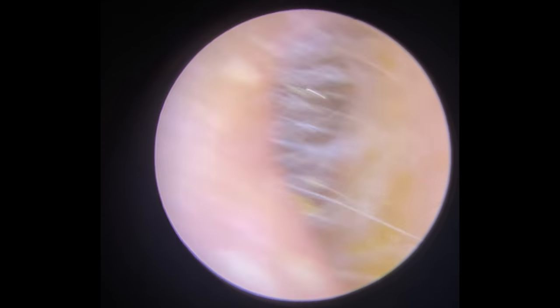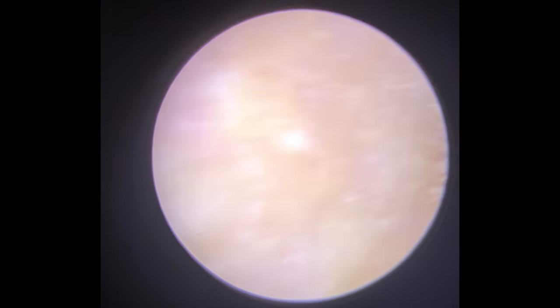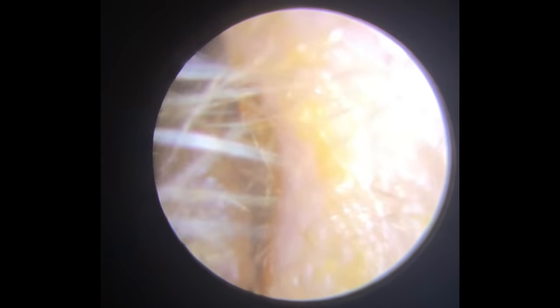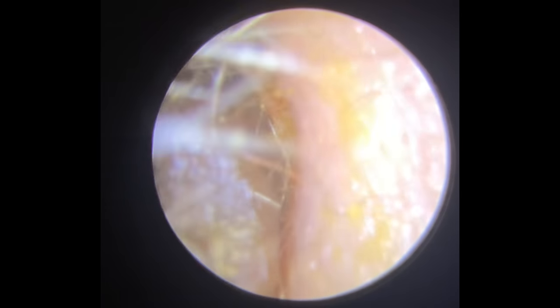Hi everybody, this is Rhys Barber from Audiology Associates. Thanks very much for watching our ear wax removal video today. Oh my goodness, this was such a big wax removal. The patient comes through very, very blocked up in both ears. We have seen this patient a good few years back, but they haven't been back in and they'd started to notice a few issues as far as their hearing was concerned.